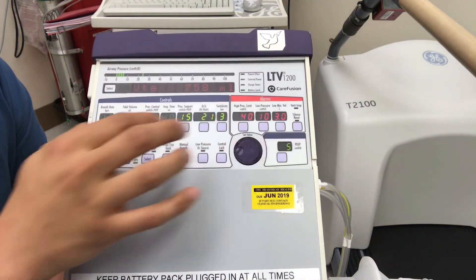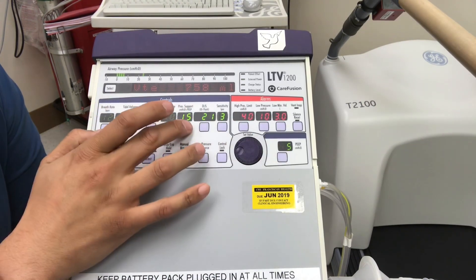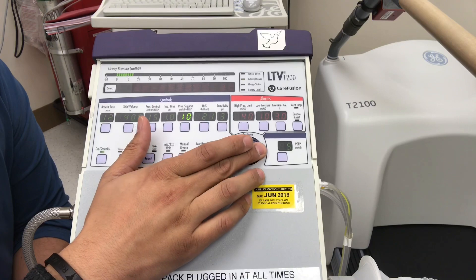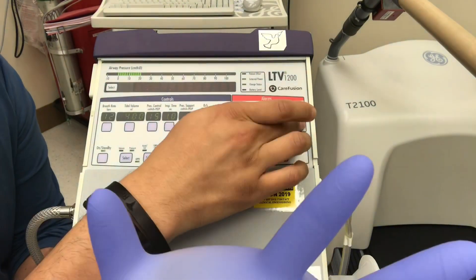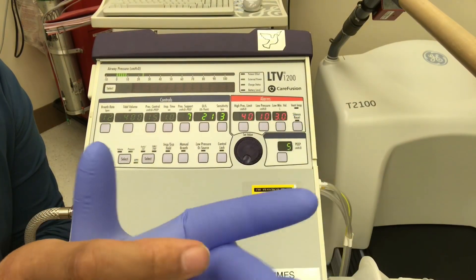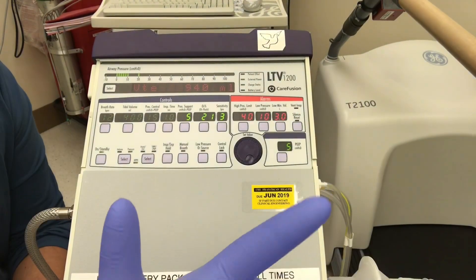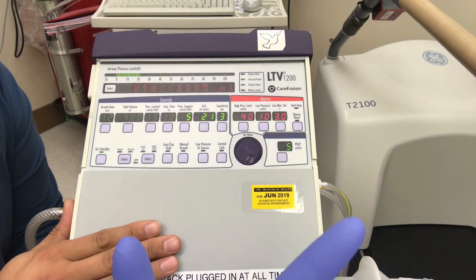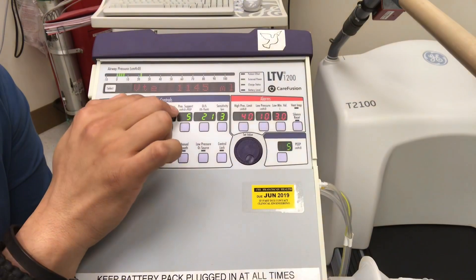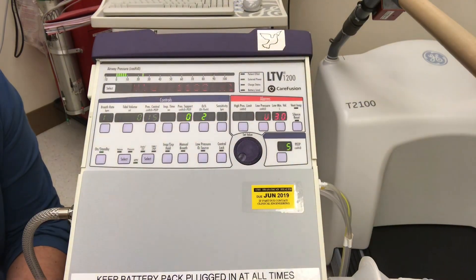An important thing to know about this machine: when dialing in IPAP, it says 'centimeters water plus P,' meaning it adds the PEEP to the IPAP value. So if you want to set 10 over 5 — a common starting point for BiPAP — you'd set 5 over 5 on this machine, because the PEEP is added to the IPAP. That means if you set 10 over 5 without knowing this, the patient is actually getting 15 over 5. That's how the LTV is designed.